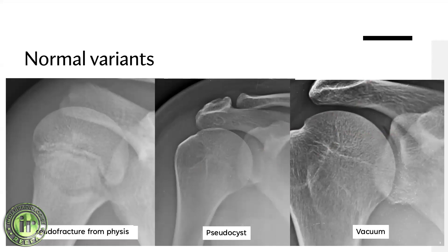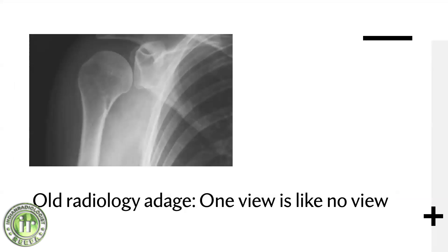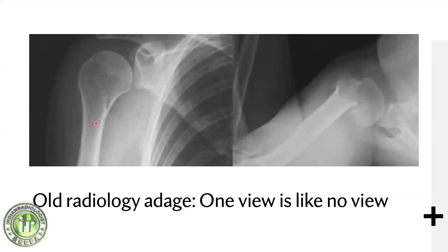There's the old radiology adage: one view is like no view. Here's an example where a humeral shaft looks relatively normal on one view, but on the axillary view there's a completely displaced surgical neck fracture. Views have an important role to play and we should know about them and their roles quite well.